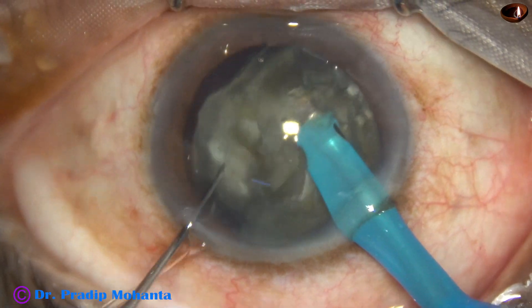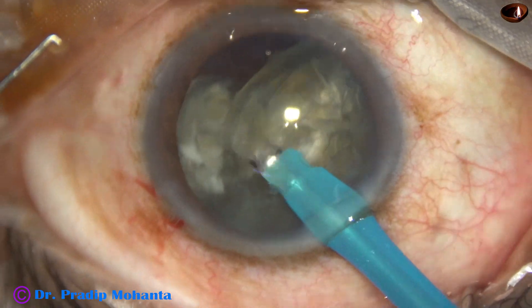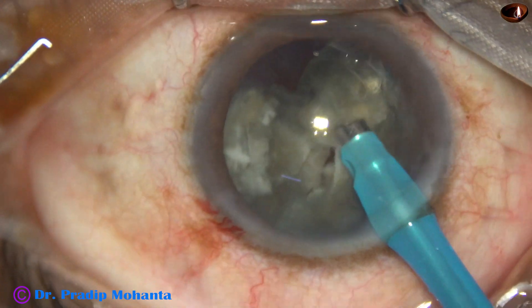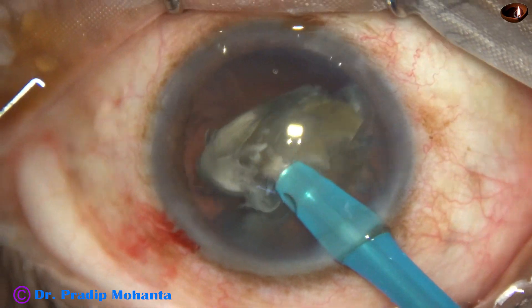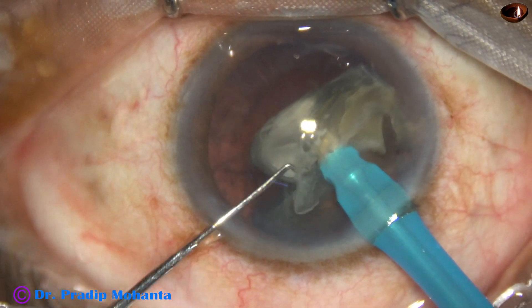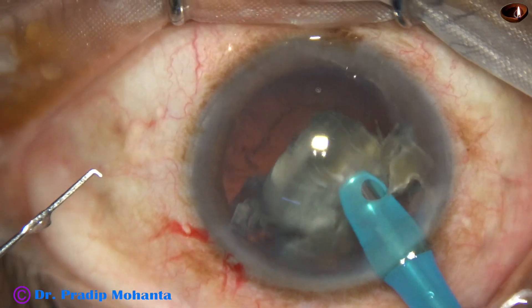This is one hemi-nucleus, being divided into two pieces. Now I am emulsifying this piece single-handedly.